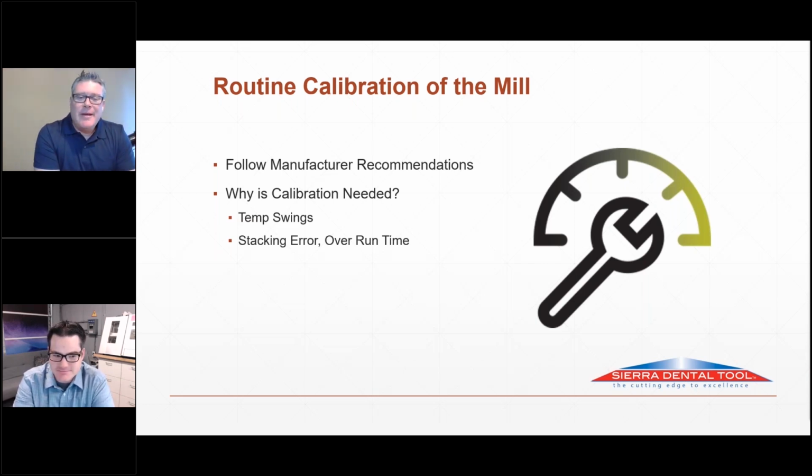The other thing is read the manual. The manual gives you really good advice on how to calibrate it. Also, we'll talk about cleanliness even more. Continue to keep the machine clean. Have some isopropyl alcohol and a brand new, spick and span microfiber cloth, so you can clean the probe itself, clean whatever calibration jig goes in the machine, or clean the touch-off sensor. The cleaner the machine is, the longer it's going to last. It's a precision device. Yeah, it is.